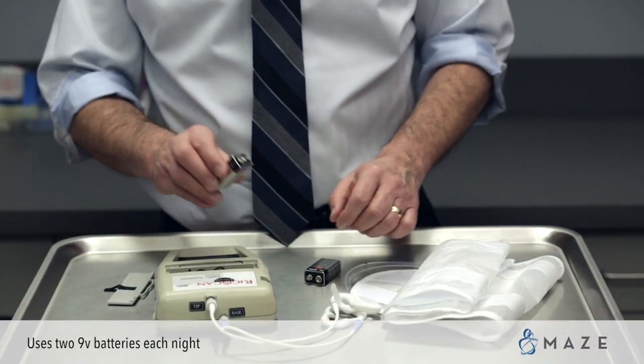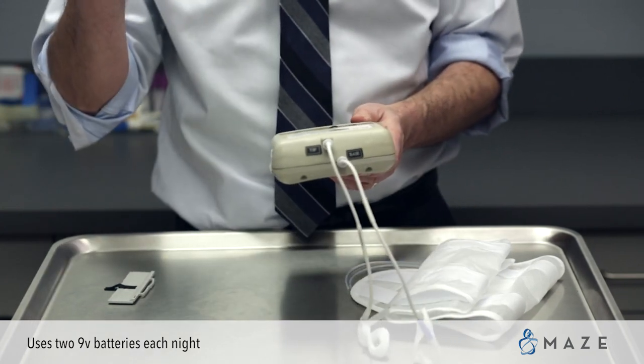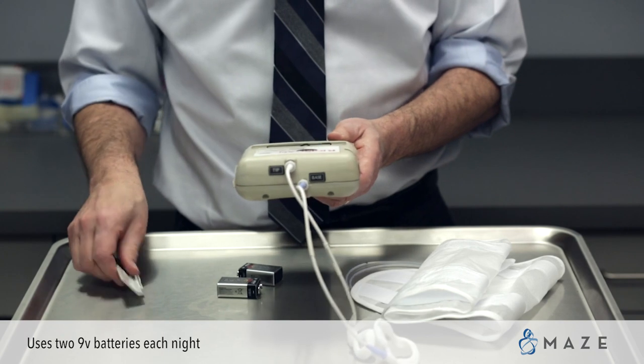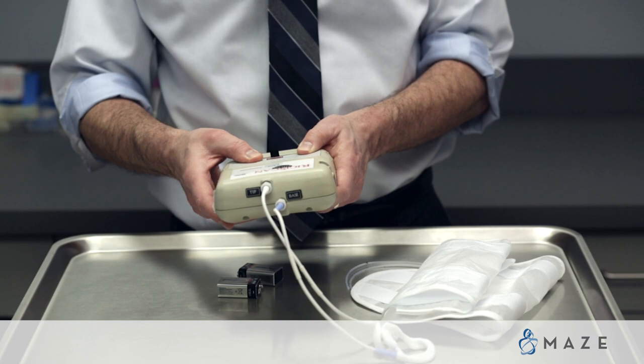The first step is pretty straightforward — you're going to load it up with batteries. We will give you six 9-volt batteries; it uses two each night. You can keep them — you'll have most of the charge. We just don't want you to run out. Then you put the cover onto the battery.